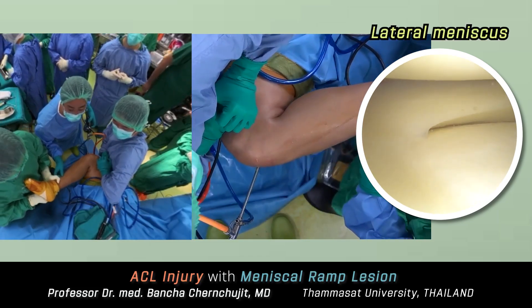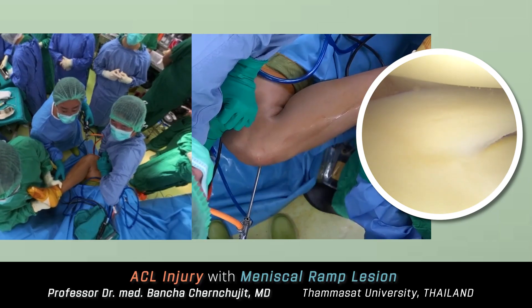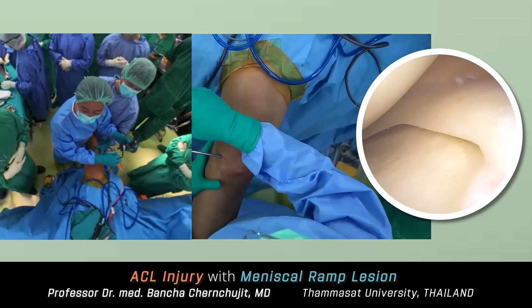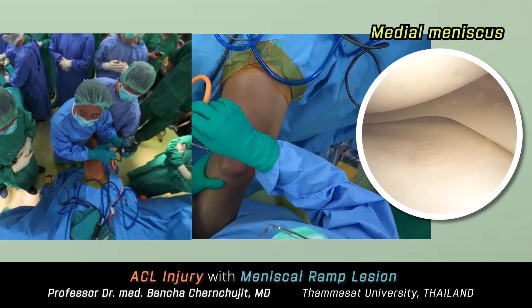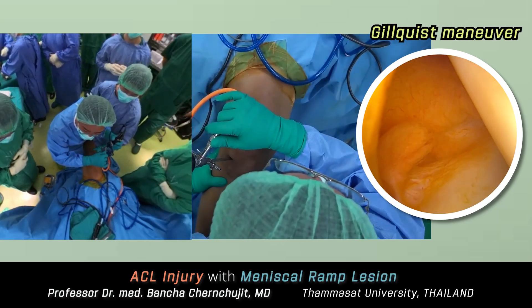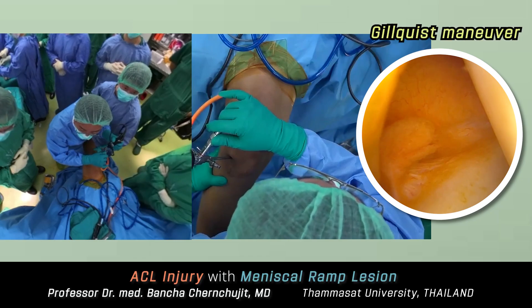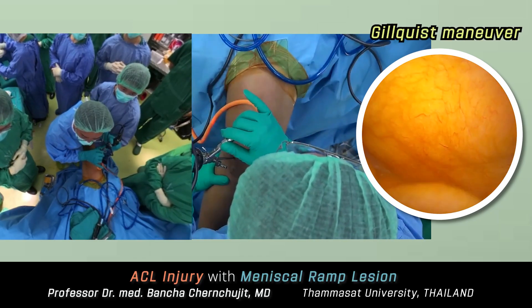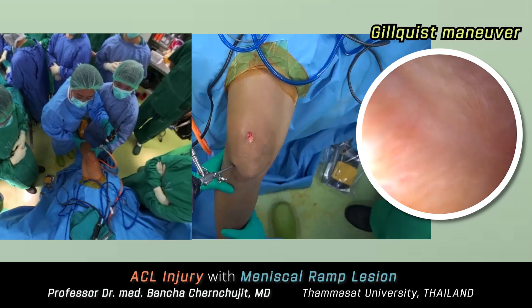In the lateral compartment, the lateral meniscus and cartilage are in good condition. On the medial side, the medial meniscus and cartilage are also unremarkable. Always put your camera in the back of the joint — drive the scope between the PCL and the medial femoral condyle. This is called the Gilquist maneuver.